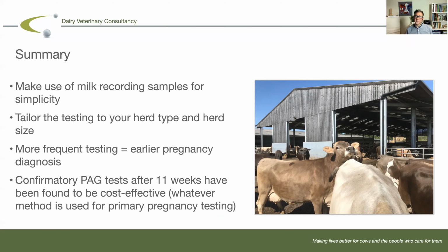So I hope you found that useful. It's a little bit of thinking about the milk PAG pregnancy test. It's reasonably new technology, but it is tried and tested. I hope these videos have helped you understand a little bit more about it, a little bit more about where it can be used with confidence and whether it's suitable for your situation.